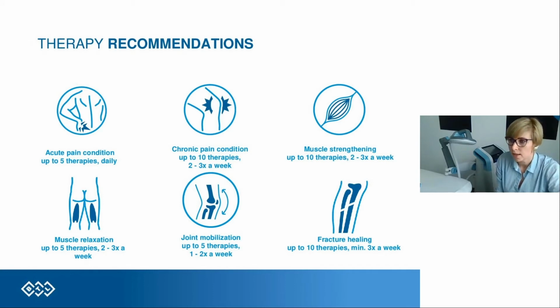In my experience, I can tell that usually from the first 2 sessions with the patients, I know how often and how to work with the patient with the superinductive system, because after the first session, when the patient comes to the second session, we are doing the interview again.